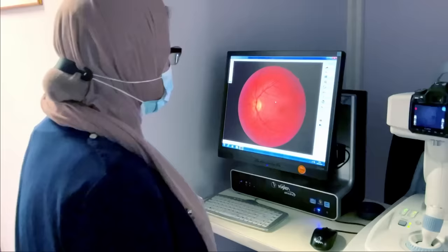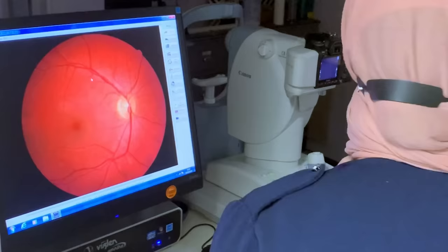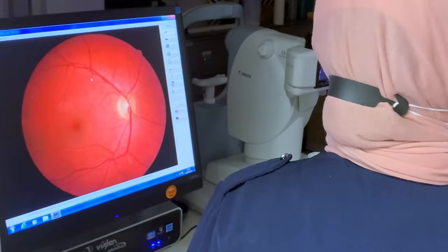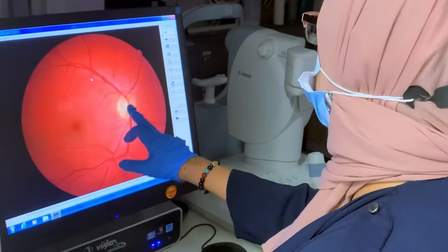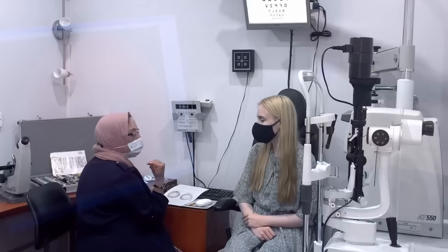I'm just going to go on to the other eye now. This is now your right eye we're looking at. It's almost symmetrically opposite. Nothing is equal, but it's very similar. Again, all the features are healthy. These are all your blood vessels, arteries and veins, coming out from where your optic nerve is. That's your macula, and all of it looks really healthy. So all is well. The back of the eye looks nice and healthy, no problems there. And we've taken an image so we can compare it every year.